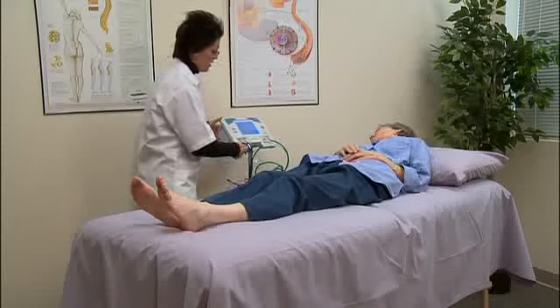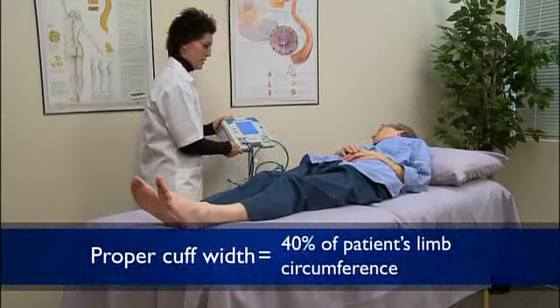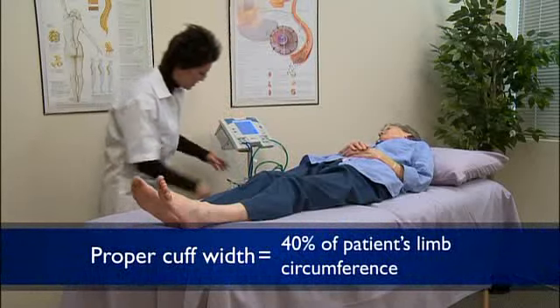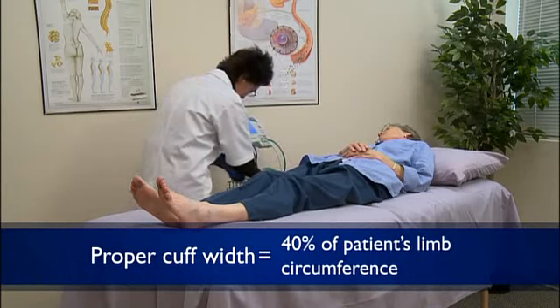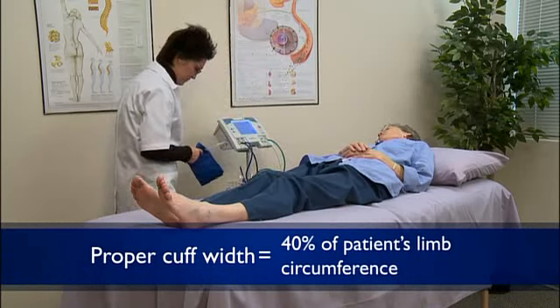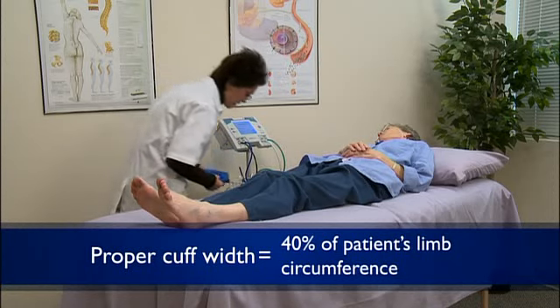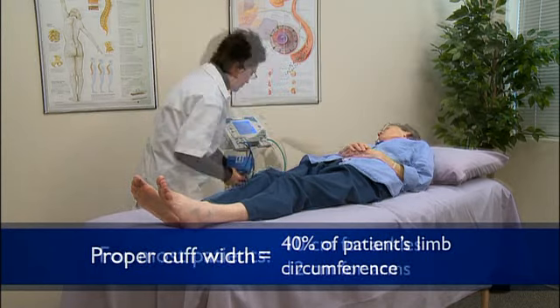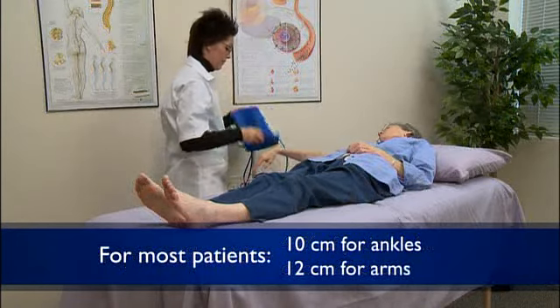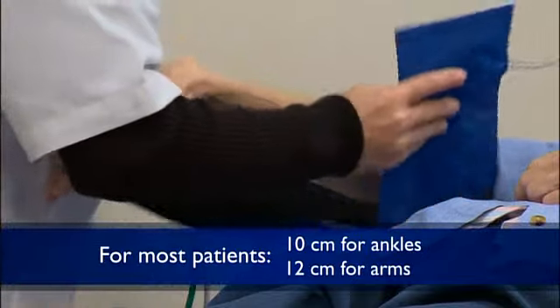It is important to select the proper size pressure cuff. The proper cuff width is 40% of the patient's limb circumference. For limbs with a circumference less than 28 centimeters or 11 inches, use the 10 centimeter cuff. For larger limbs, use the 12 centimeter cuff. For most patients, a 10 centimeter cuff is used at the ankles and a 12 centimeter cuff at the arms.